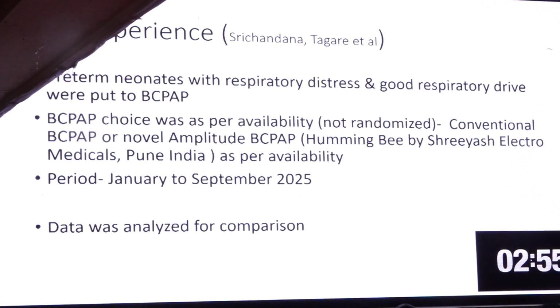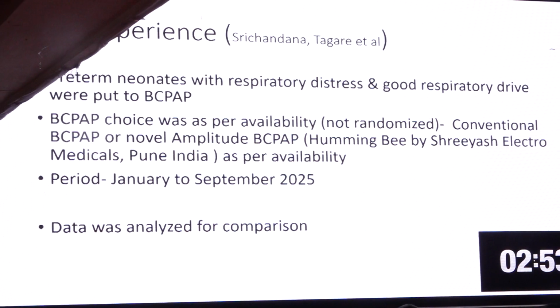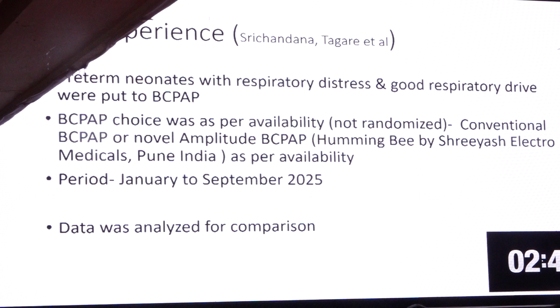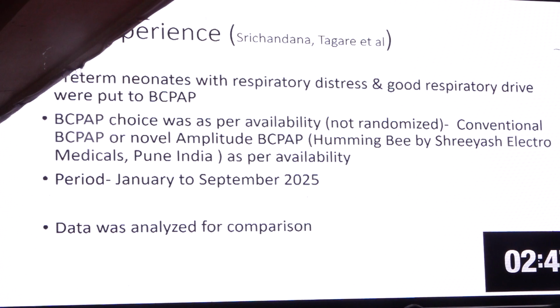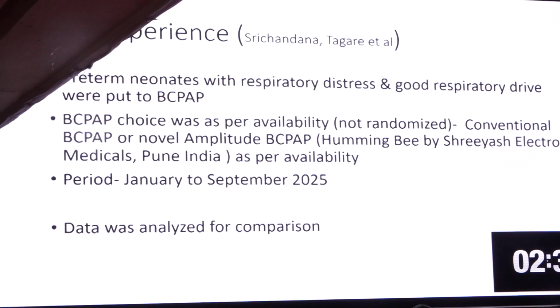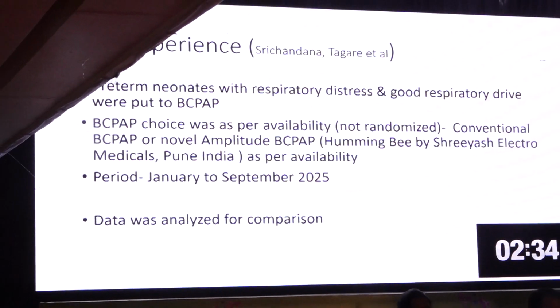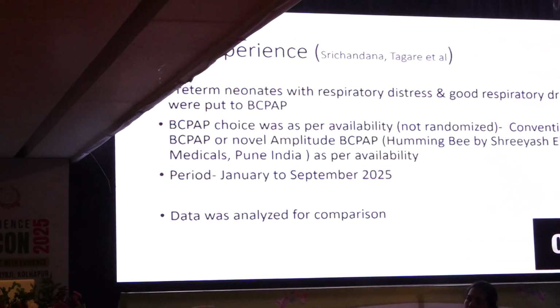Now can it be tried in the real world? Now it is already being used. We had our own experience. Initially for 3-4 months a lot of modifications had to be done, and they were done by Shreeyash team, and finally we had around 28 babies on bubble CPAP, partly on amplitude and some on conventional.